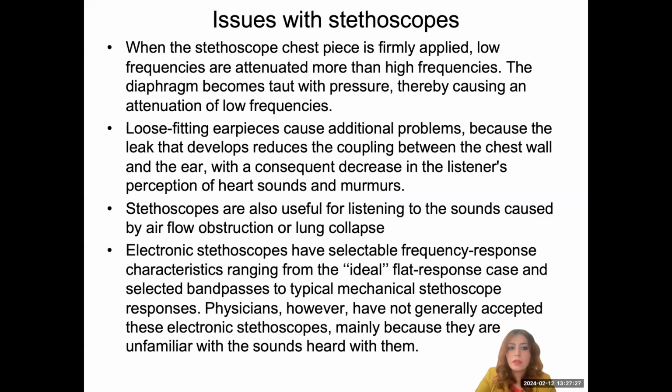Yes, some details, some issues with the stethoscope. When the stethoscope chest piece is firmly applied, low frequencies are attenuated more than high frequencies. The diaphragm becomes taut with pressure, thereby causing an attenuation of low frequencies. Loose fitting earpieces cause some additional problems because the leak that develops reduces the coupling between the chest wall and the ear, with a consequent decrease in the listener's perception of heart sounds and murmurs.